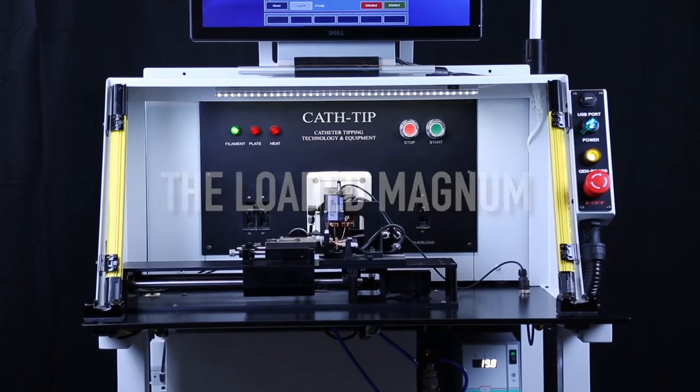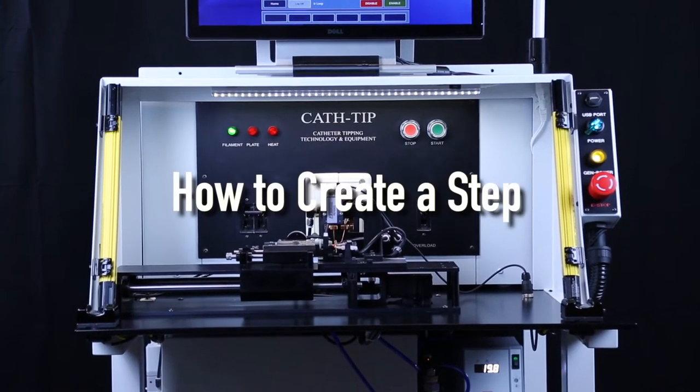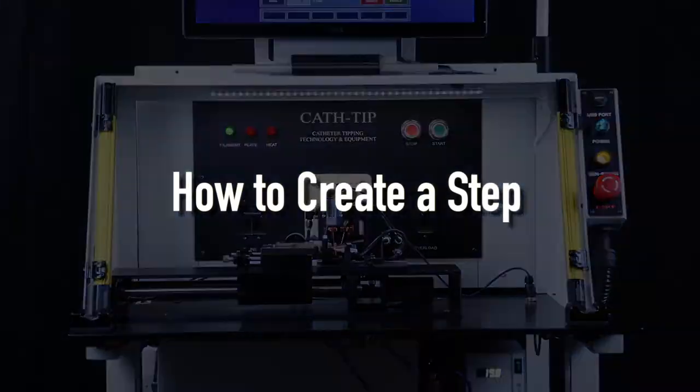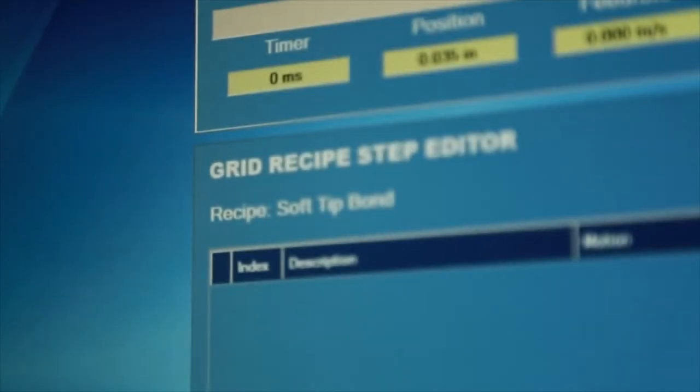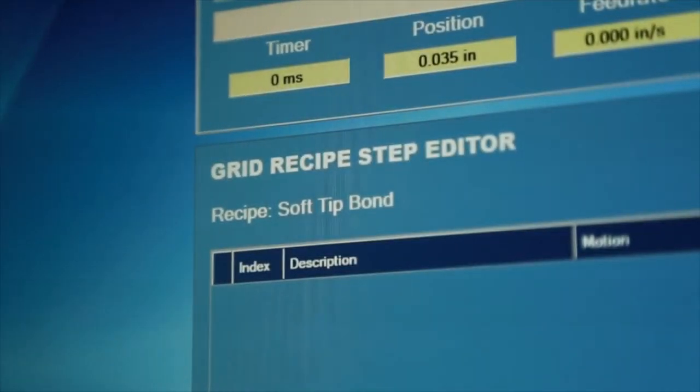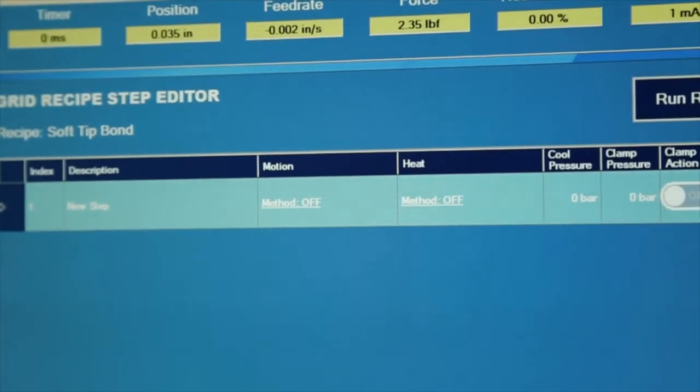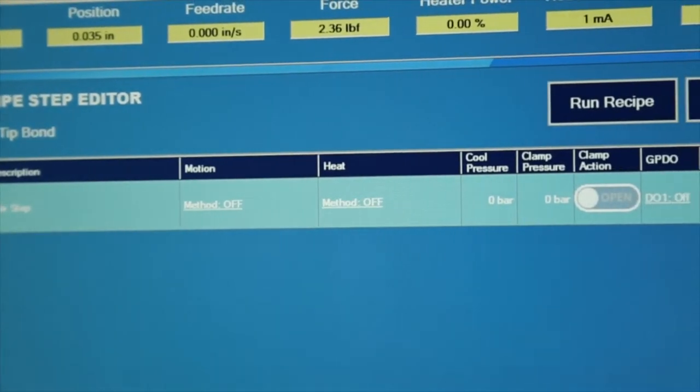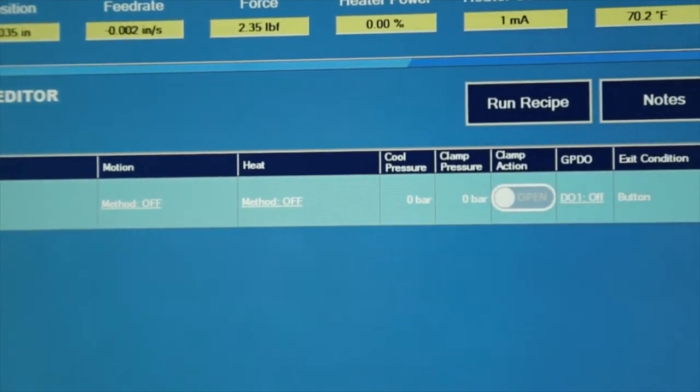On the Magnum's 3.0 software, creating a step on the grid style recipe maker is quick and easy. Each step consists of actions and one exit condition.